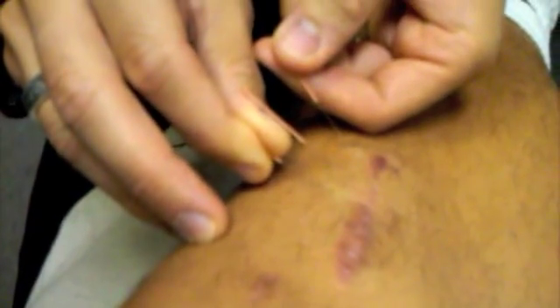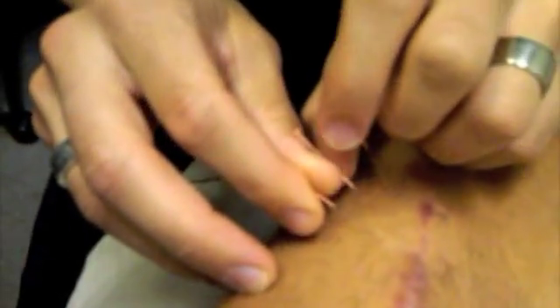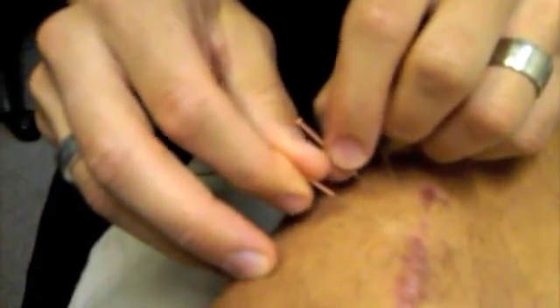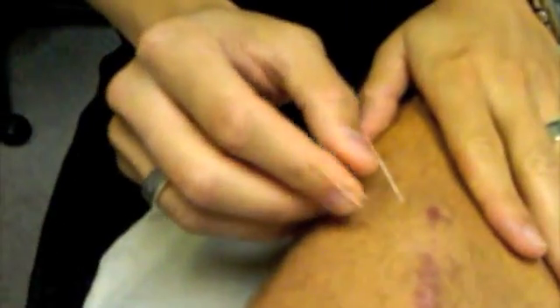And if you hold that pressure, you're going to allow for the intercellular signaling, which will bring about cytoskeleton changes as per Langevin's article that I posted a few days ago. So you just do this all around the scar itself.